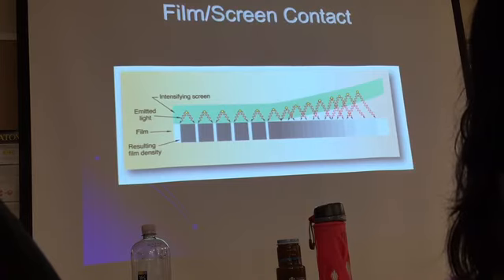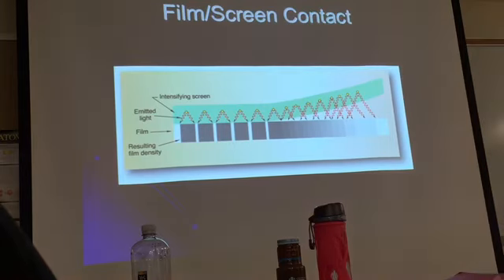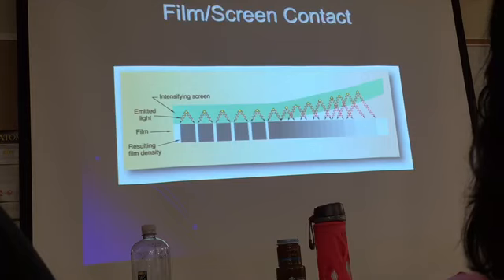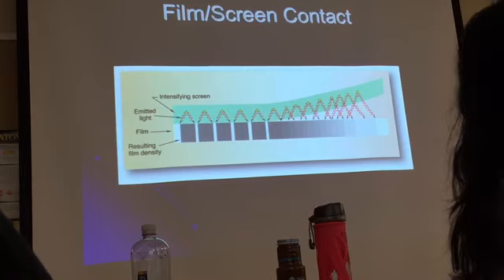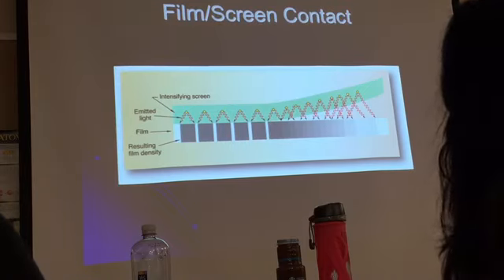That's what you had. Okay, or what people will do is they will do weight-bearing feet, and they will have the patients stand on the screens, and that will warp the screens. So if you end up working with this, you have to make sure that you don't put any weight on it, because that will happen. You're going to have areas that are going to be closer to the film than other areas.